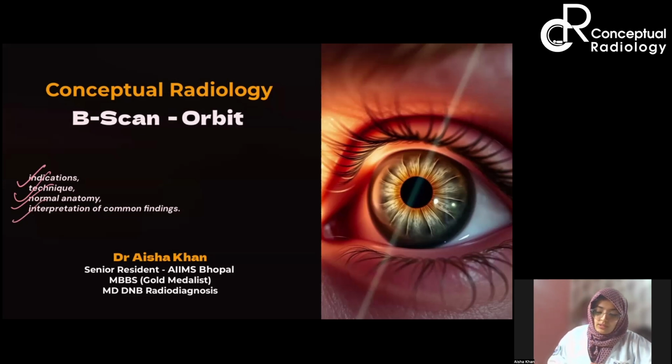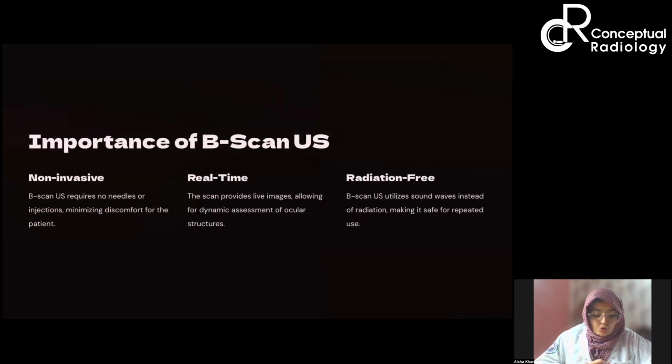Okay. Right. So what is the importance of B-scan ultrasound? Number one is that it is non-invasive. B-scan ultrasound requires no needles, no injections, minimizing the discomfort, no contrast, as well as no radiation exposure. If you get any long question in exam about any modality, you can always spare at least one paragraph and a few points in which you can write about the advantages of that modality and how it is better than the other relevant modalities.